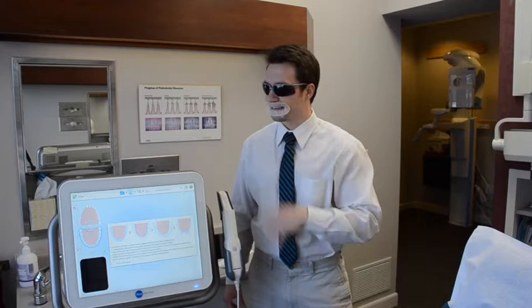You might be wondering why I had this in my mouth. Well, this helps with the scan, and what we're going to do here shortly is take a video of one of our lovely assistants, Shayla here, scanning my teeth to show you how this works. Enjoy.